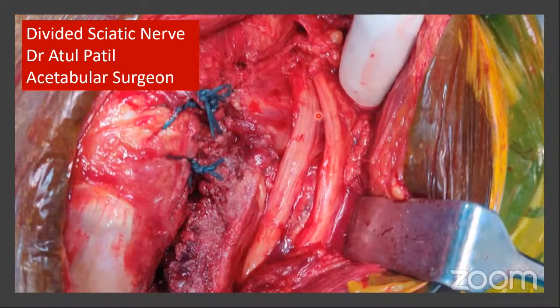Yeah, definitely. See, dual block is anytime much better than individual. The advantage of ultrasound is definitely to locate the nerve properly, and the advantage of the PNS is to prevent intraneural injection. I definitely would like to have a dual block if I have both available.